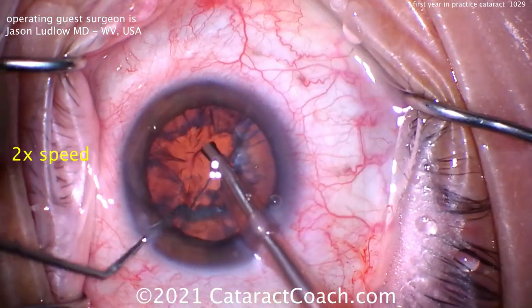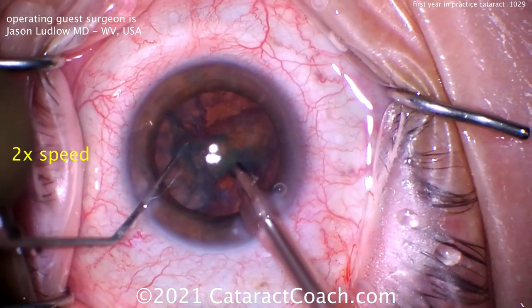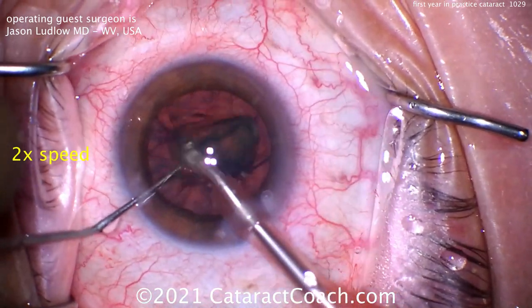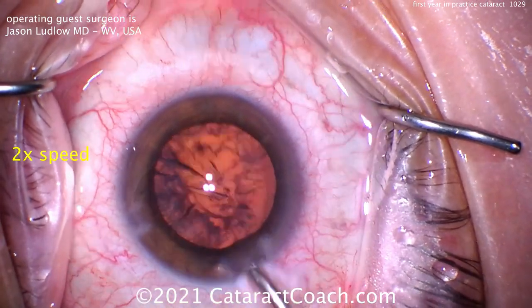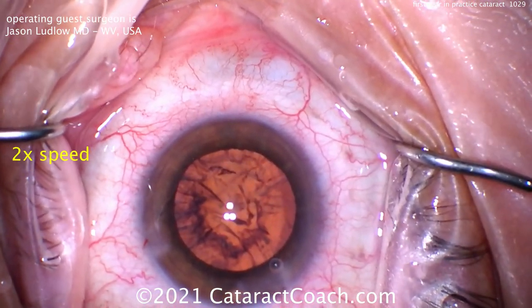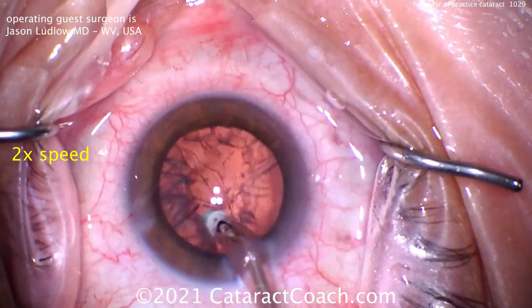Notice how the eye stays in primary position, the draping is good, all the lashes are out of the way, and the focus is good — the whole case is in focus. Another chop taking out the last two quadrants of the nucleus. Very good control, no bounce in the anterior chamber, great stability. Clearly he has really put in the effort to make his surgical skills top notch. For the first year in practice, I'm very much impressed. I would have guessed this person has been in practice at least five, maybe even ten years.